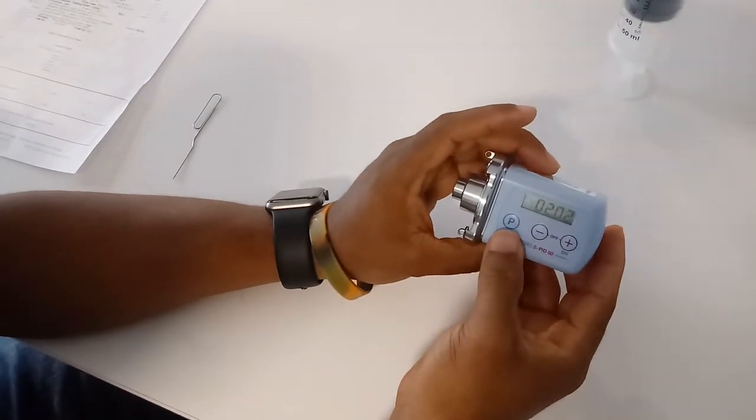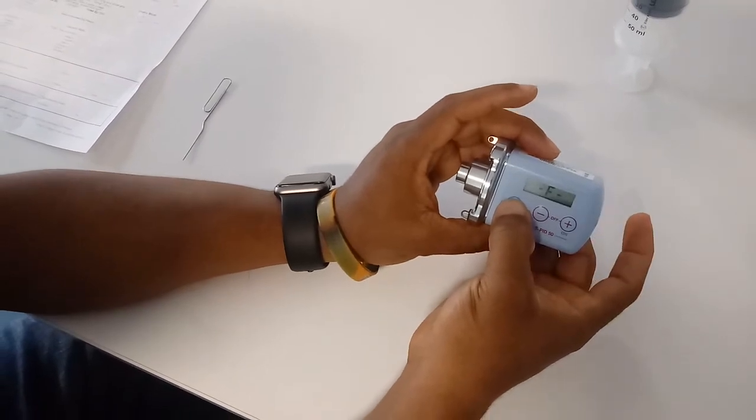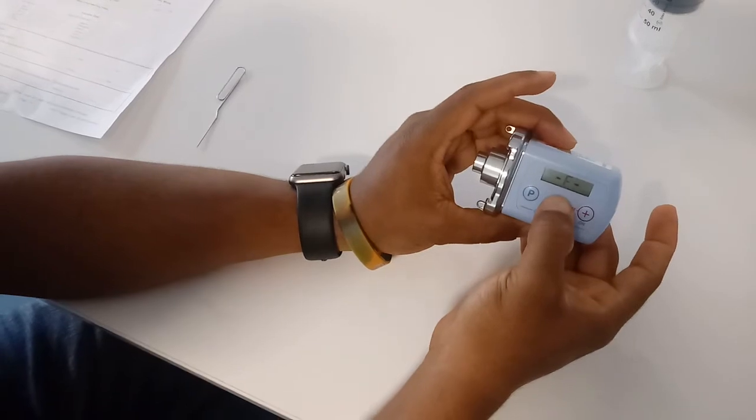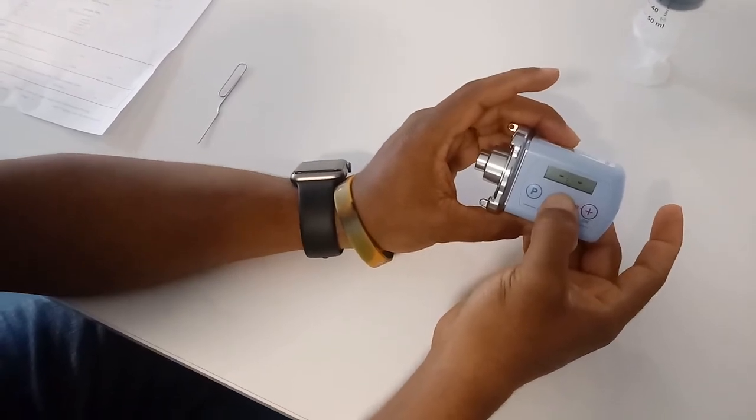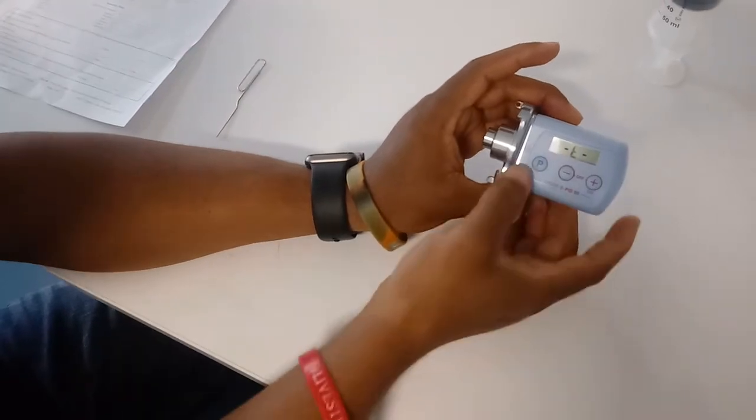Okay, so right now we're going to be switching the pump from F mode to time mode. Press the P button until you hear a little peep sound. Once it's blinking, hit the minus sign and it will switch out to time mode. We are now in time mode.